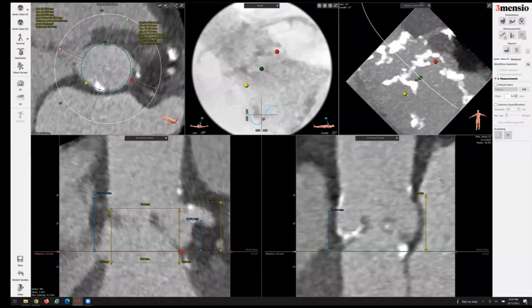Today we're going to talk about pre-procedural workup in a patient with native aortic stenosis for TAVR that might potentially be high risk of coronary obstruction.